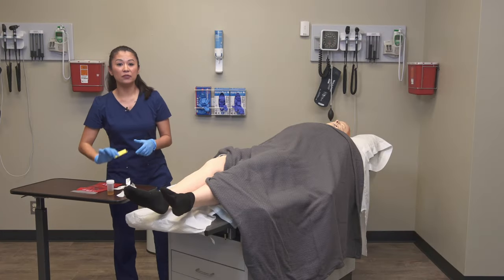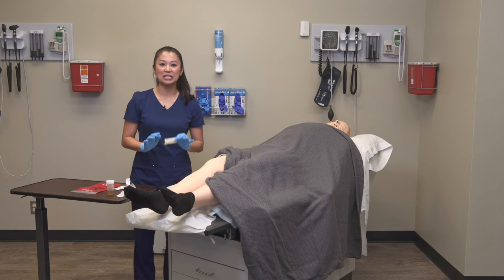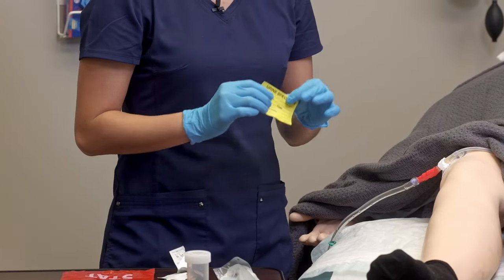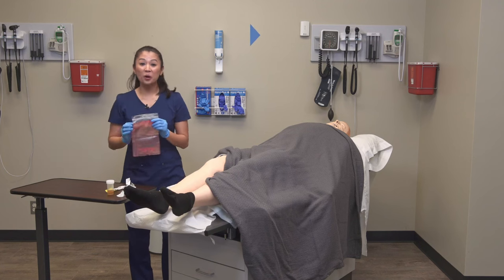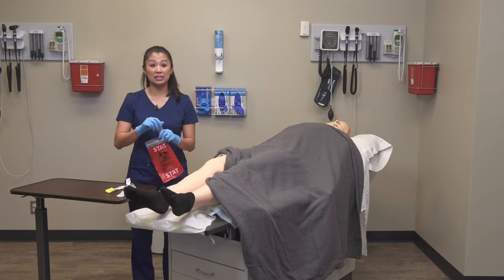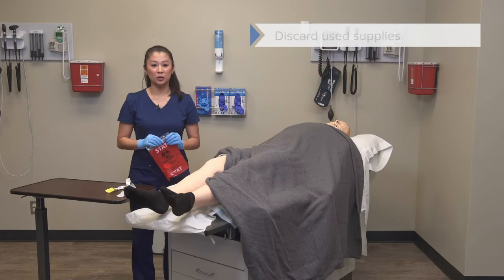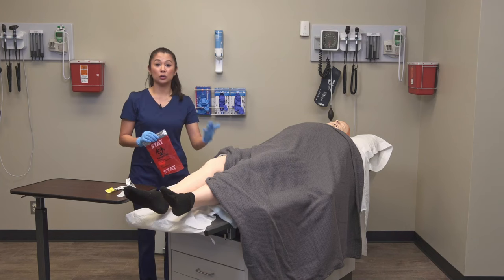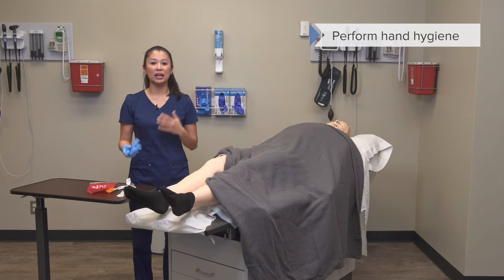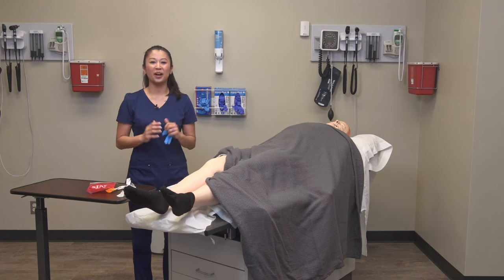I'm going to take my label — every facility is a little bit different on what the label looks like, but you'll notice some commonalities: you definitely need the date, the patient's name, and all of the different components that are on your label. Make sure you label the specimen container at the bedside. Don't forget to place it into a biohazard bag — as you can imagine with transport, there may be urine on the outside of the sample, so we want to make sure it stays secure. Discard all of your used supplies and before you leave the patient, make sure the bed is in the lowest position. Remove your gloves, perform your hand hygiene, and document the procedure. It's important to ensure that urine sample is transferred to the lab immediately and stored according to facility protocols.